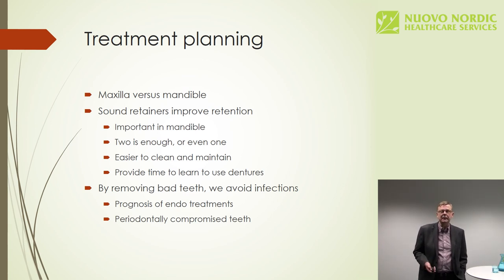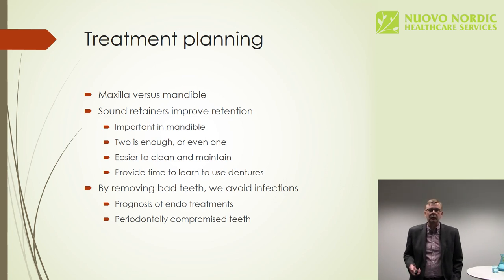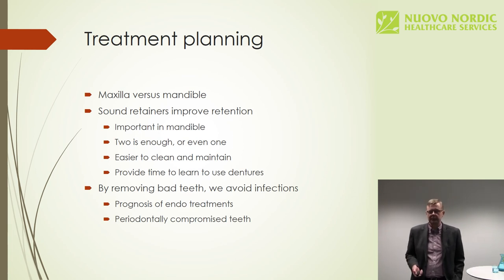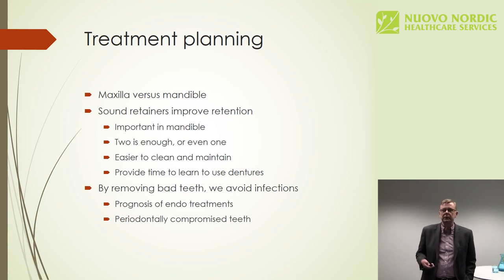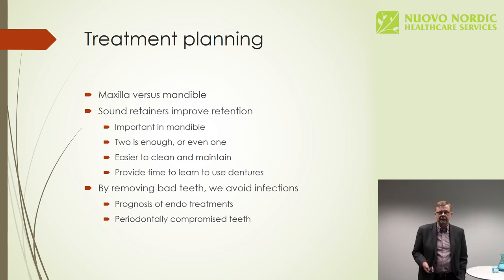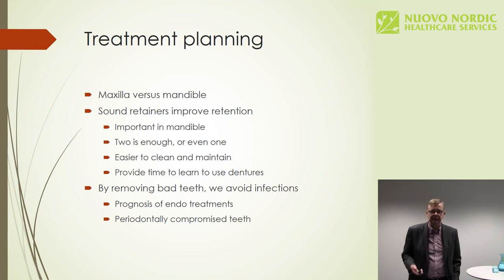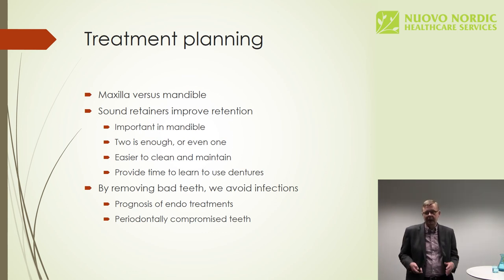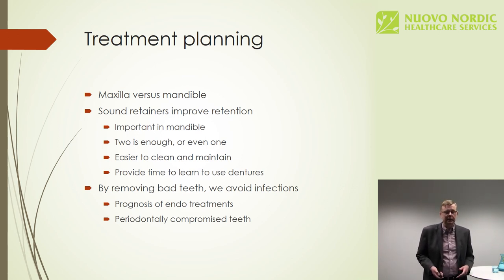As with all treatments, this will start with the treatment planning. We know the difference between the maxilla and the mandible in terms of retention, as I mentioned. However, we should select the good teeth for the mandible. By removing bad teeth, of course, we'll limit the sources of infection. And also, if we keep the good ones, then the prognosis of the dentures will be much better because we can expect the teeth to remain there longer.